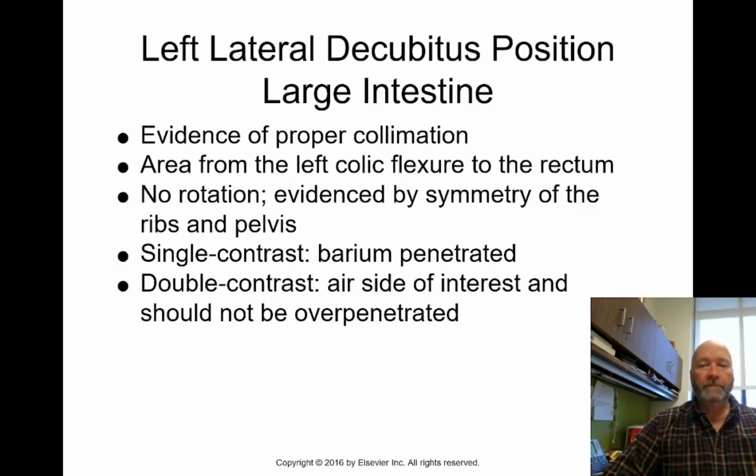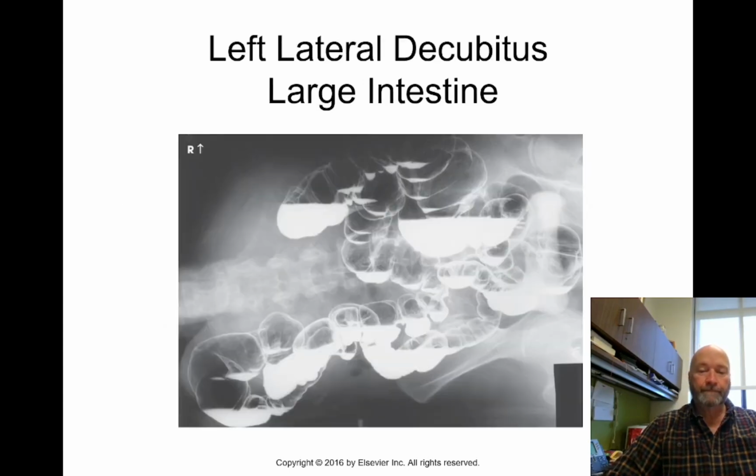So your left lateral decubitus position, you want everything. And you may be back to having to shoot 2 images for hypersthenic patients. So again, we'll look at this. Again, we've got the same situation here. We've got air in the medial side of the descending colon. We've got air in the lateral side of the ascending colon. We've got splenic flexure. We've got hepatic flexure.